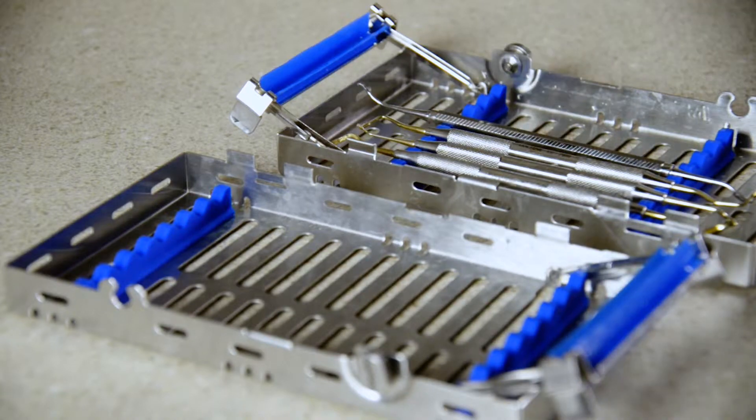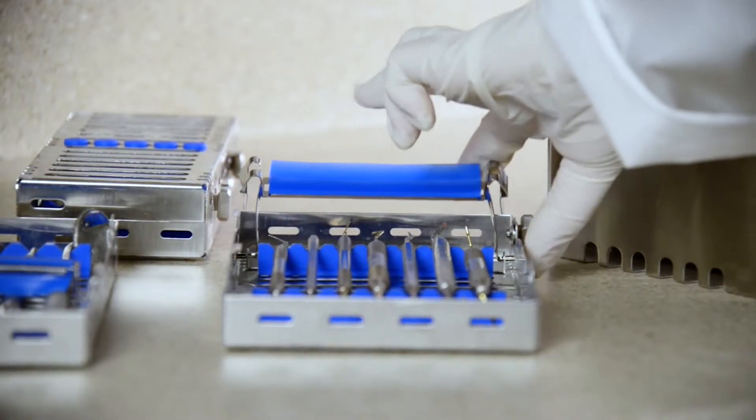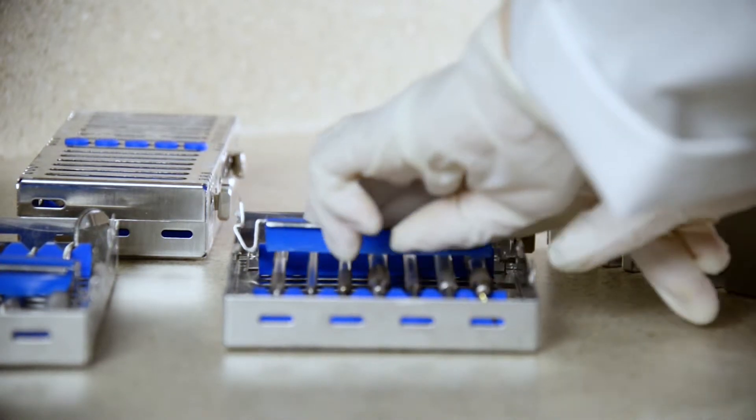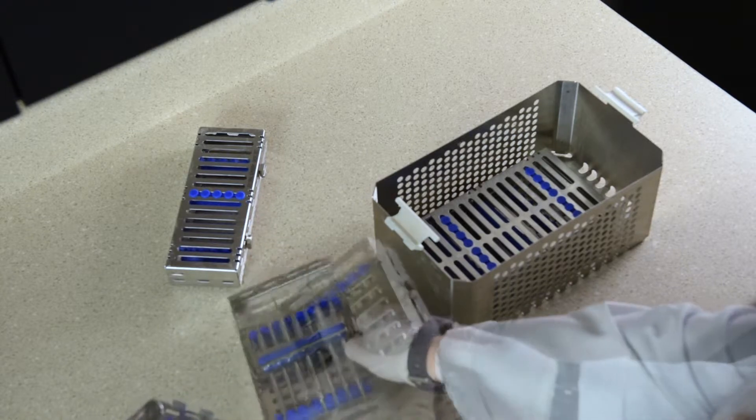A larger load will require a longer cleaning cycle. Placing instruments in the basket so that they overlap is not recommended, as open surface areas will be easier to clean. Leaving clear space between instruments in a basket should lead to a more effective cleaning cycle.